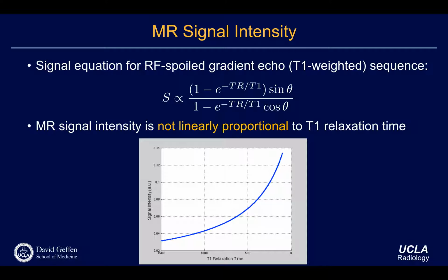I'll be talking about the B1 issues later, but the B1 issues are more about the shape and the tissue, not the contrast agent. The contrast agent typically just perturbs the relaxation rate only, so the T1 and T2. So if you have a tissue, it will change your T1 and T2, meaning when you inject the contrast agent, considering there is no B1 variation, this will be constant, but this will change. So only the contrast agent will change the T1 and T2 components, but this one is purely T1 weighted, so there are no T2 components. That way, it only changes the T1. But in practice, whenever you have high field imaging, like 3T or 7T imaging, there's a B1 variation, meaning there's ambiguity on the flip angle side. But considering there's no B1 variation, the flip angle that you're assuming will be implemented exactly as it is. Okay? Does it make sense?